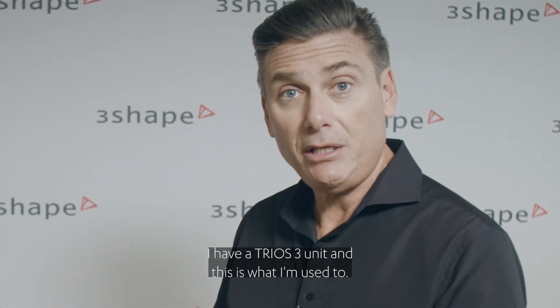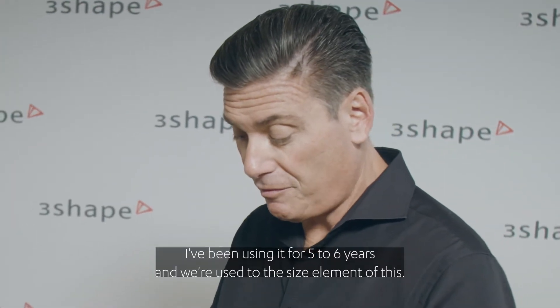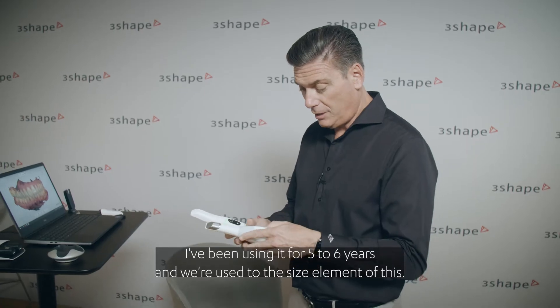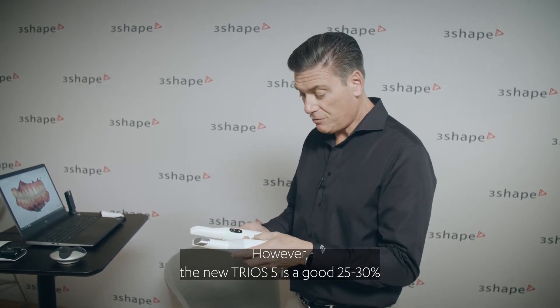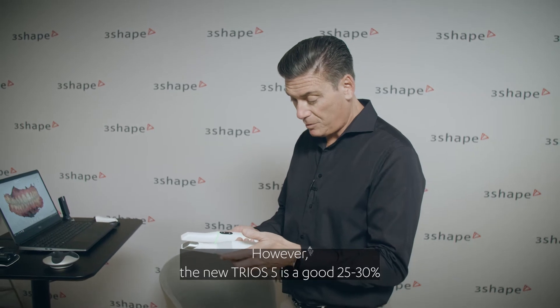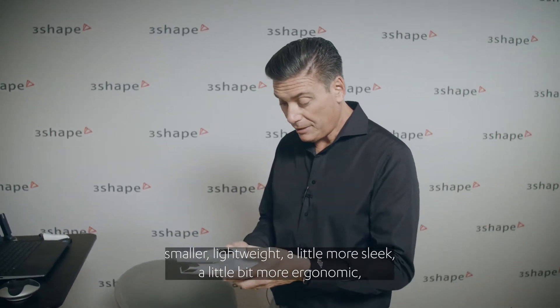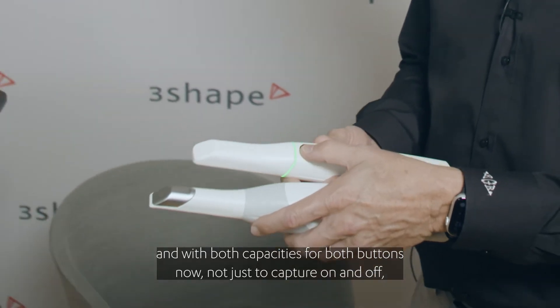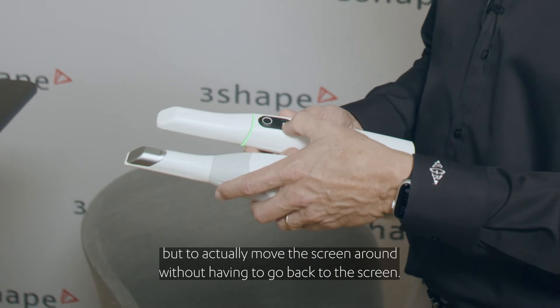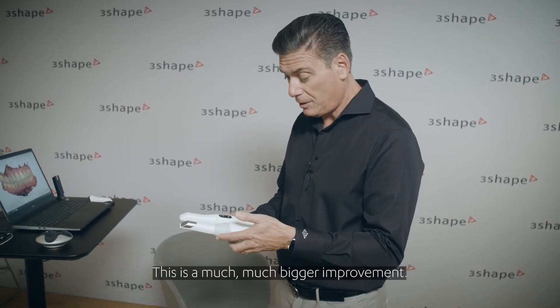I have a Trios 3 unit and I've been using it for five to six years — we're used to the size element of it. However, the new Trios 5 is a good 25 to 30% smaller, lightweight, a little more sleek, a little more ergonomic, and with both button capacities now — not just to capture on and off, but to actually move the screen around without having to go back to the screen. This is a much bigger improvement.